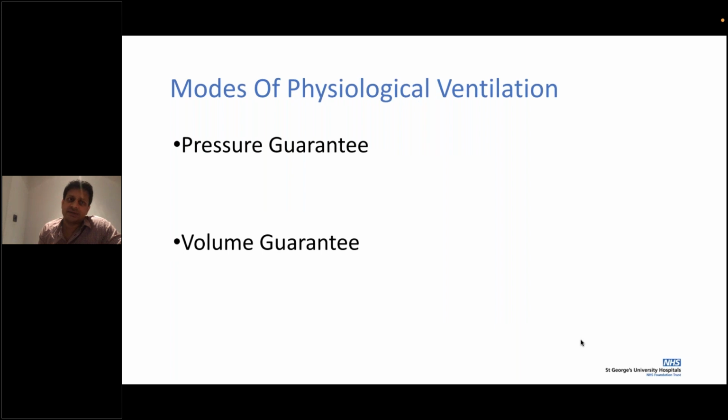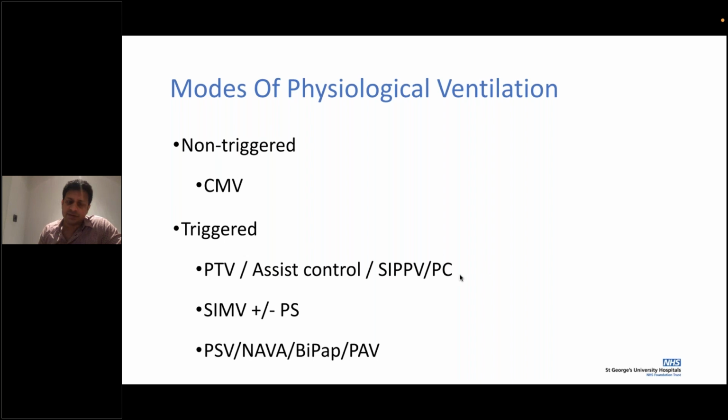So let's just summarize. Basically there are two modes of ventilation. One is pressure mode of ventilation, the other is volume mode of ventilation. Now, what does that mean? With pressure mode of ventilation, we are not able to completely control the amount of volume that is delivered, and we know that volume trauma onto the lungs is significant. So we're looking at what are the different pressure modes of ventilation.